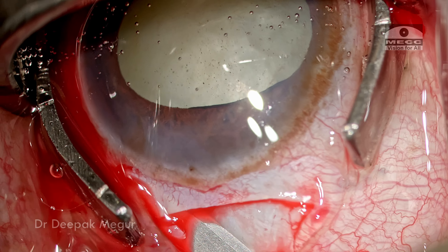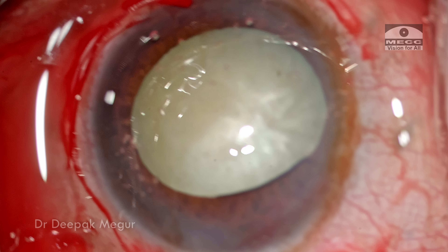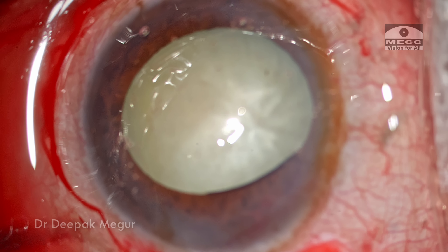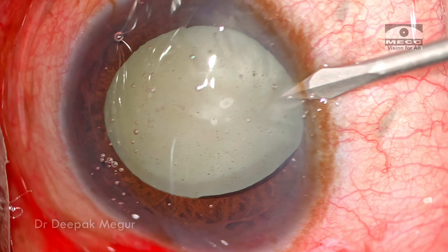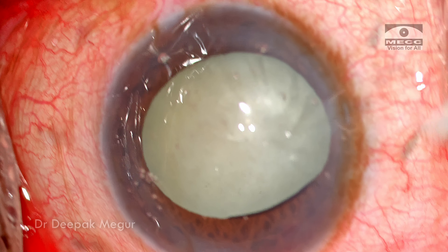The inner part of the corneal dissection is also carried out. Now is the time to perform the side port incisions. Since I'm going to use bimanual I&A for cortex aspiration, I'm using MVR blades to create those small side ports.